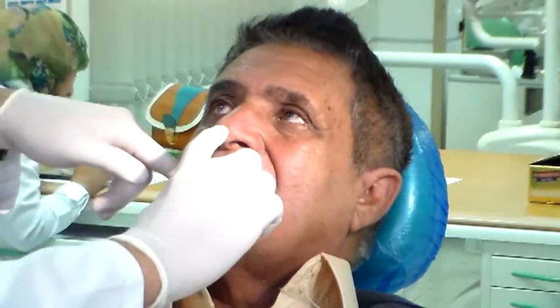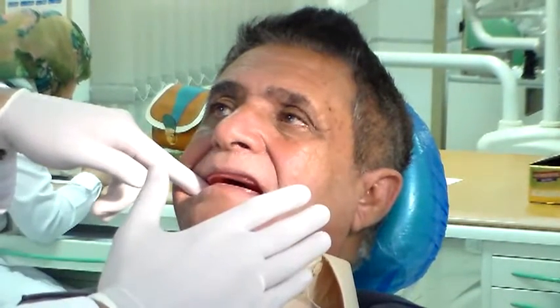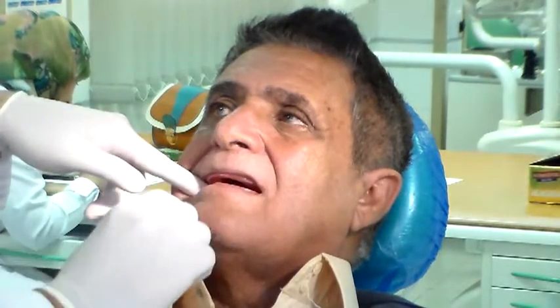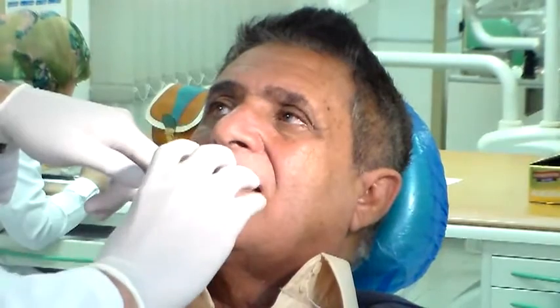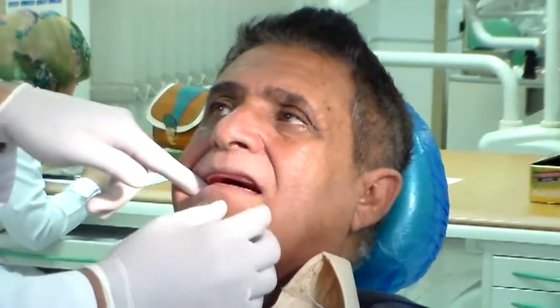If you know the vertical dimension at rest, then you can calculate the vertical dimension at occlusion. It will be about 3 or 4 millimeters maximum less than the vertical dimension at rest. If you know this, you can measure and see. If the vertical dimension of occlusion is too high, you want to reduce. If it's less than what you need, you want to add. So this is how we decide whether to add or reduce.